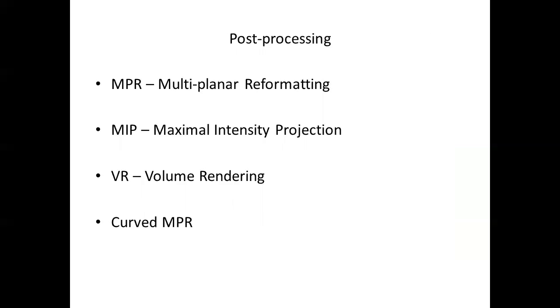Okay. So just quickly about post-processing. I don't know if you guys have heard these terms before. You get your raw data, which is the axial stacks. Not very helpful because coronaries don't follow the axis as a CT does. So you do something called MPR, multiplanar reformatting, which is basically you stack all the axial imaging into a 3D data set that we can then manipulate to lay out a coronary in its axis, not the body's axis. This is still our workhorse and where you get the maximum resolution. If you really want to maximize it, it's a little pain, and we'll talk about why.